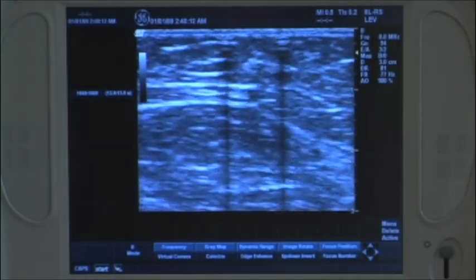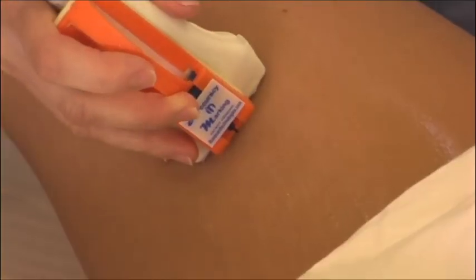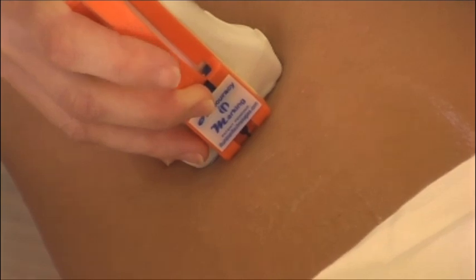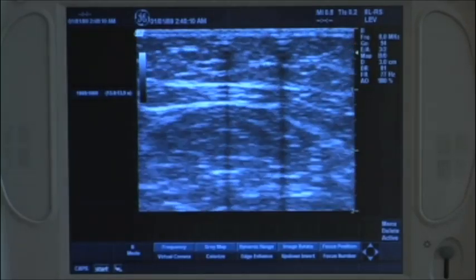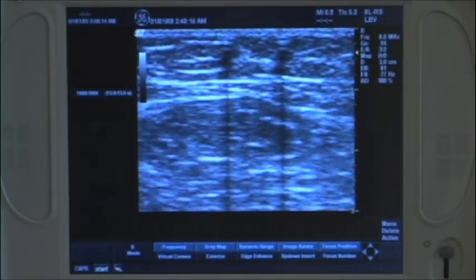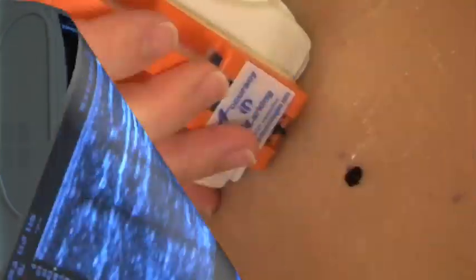Center the target anatomy between the two reference lines. To deliver an ink mark, first compress the centered anatomy with the transducer, then squeeze the actuator. This image shows the target anatomy centered between the reference lines and the subsequent compression of the anatomy and delivery of the mark.